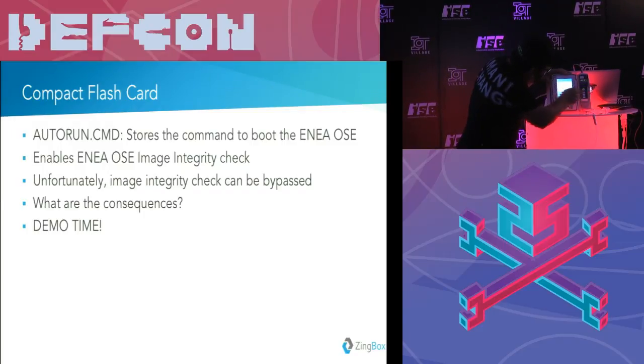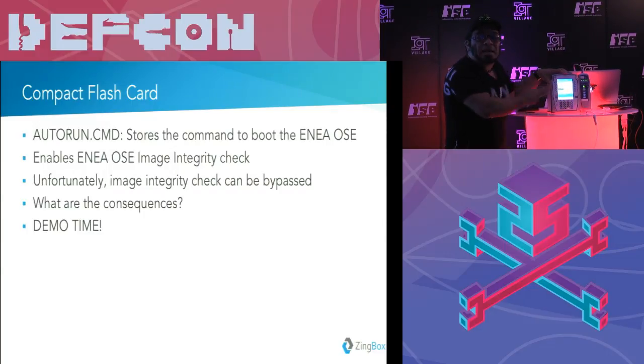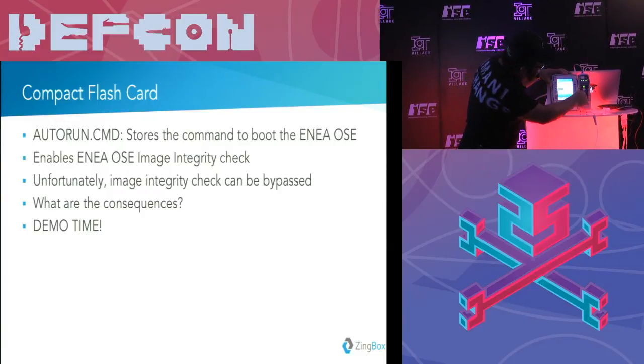So what that means is that if someone comes and wants to prepare the infusion, they're going to say, okay, let me enter the rate. And I don't know, let's say 50. And then they are going to say, okay, so the duration might be 3 hours, for example. So what is happening here is that we are entering the rate, but the rate is actually the VTBI, and the VTBI is the rate, you know what I mean? So we swapped it. So check it out when I say start. It says 50 here, but it's actually infusing 14.